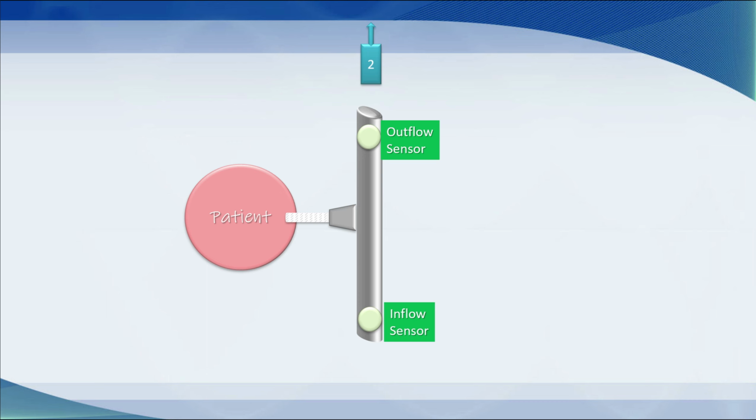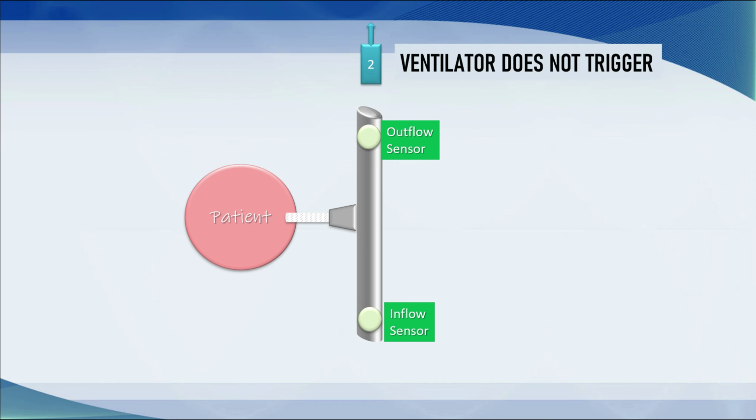Because flow was not deflected, either not at all or insufficiently during that flow through the system, the ventilator does not trigger. We don't pass sufficient magnitude of flow being deflected into the patient to quantify that a breath should be given. And that's likely what's happening with Eddie here. He doesn't take big enough breaths with the amount of flow by that is being dialed up to trigger the ventilator.